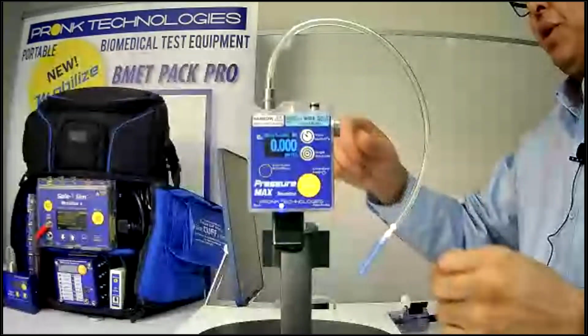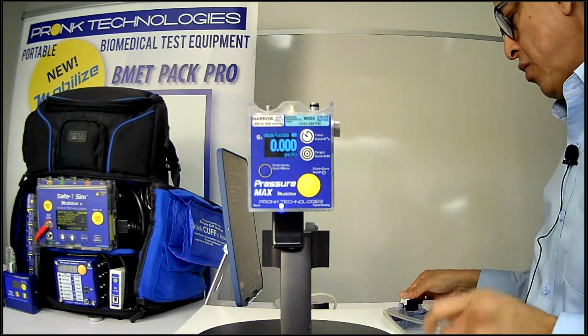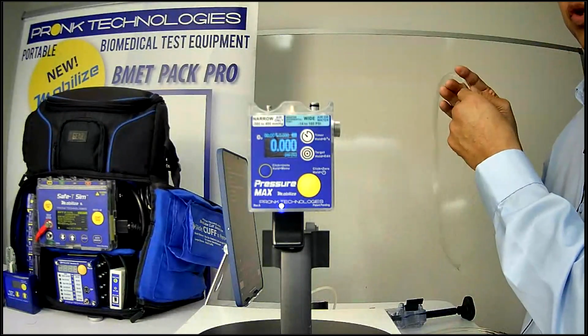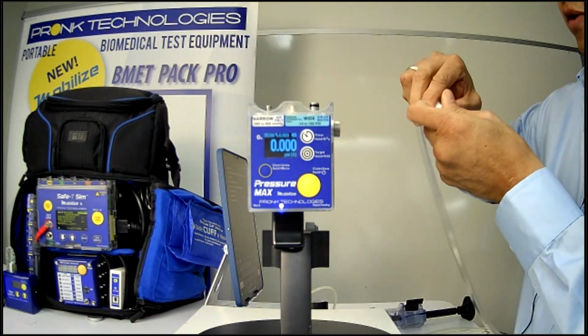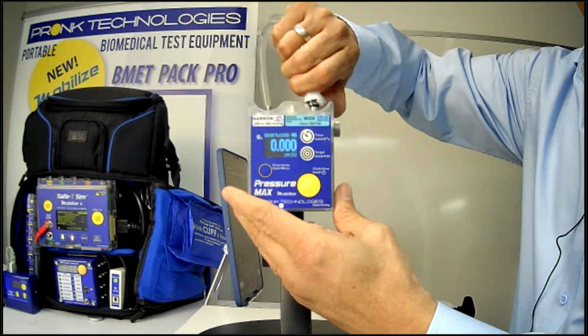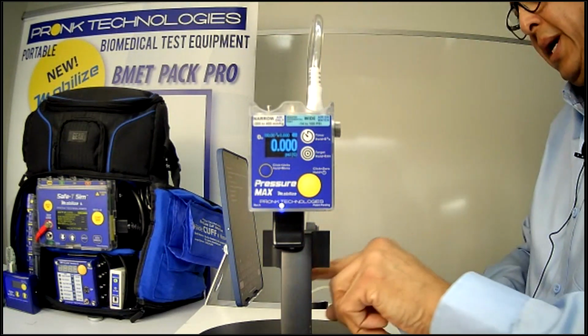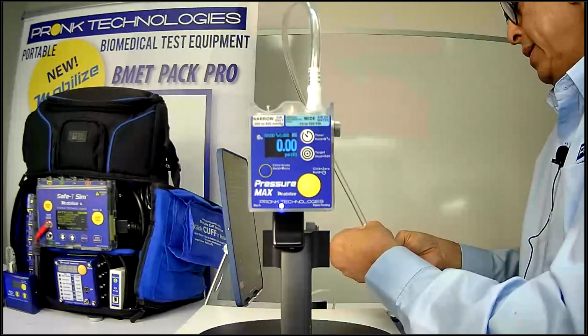Now the wide port, as I mentioned, has a high pressure connector on it. So we include with our unit a set of accessories you'll need to be able to utilize it, including a high pressure connector here. So we can be sure to measure pressure properly and safely. So we'll just do a quick check on that real quick. It locks right in there, so it's not going to come loose during a pressure measurement. So I'm going to connect this over here.